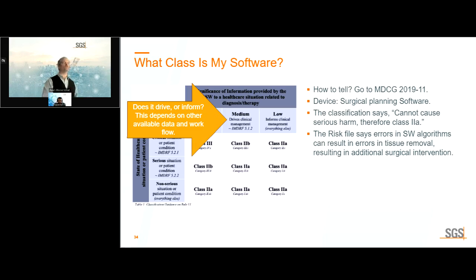Whether it drives management or informs management, there is no strict definition of these two objects. So I can't say to you, go look at the following MDCG, the definition is right here. This is very much dependent upon available data and what is the workflow in the use. So we will care a lot exactly how the software is used, where exactly is it used, and how the doctors or the clinical staff interact with it. Is it really driving the management and they're not really going to get a lot of data from other locations, or they have a very data-rich environment and this is one piece and it just informs the clinical management? So again, claims are everything.